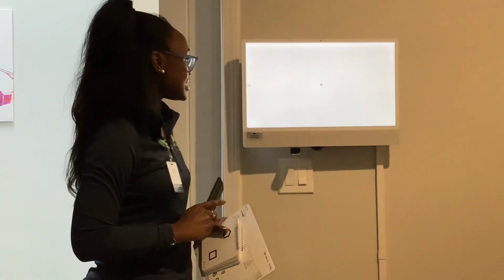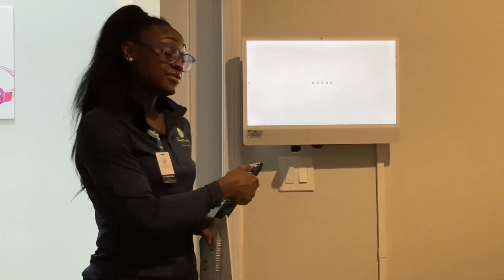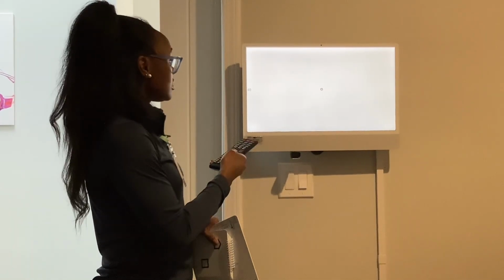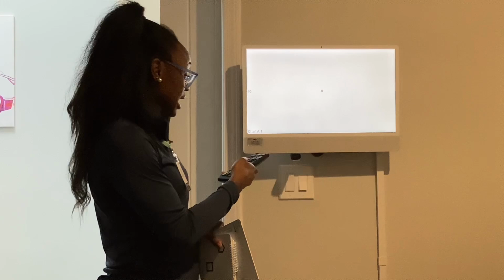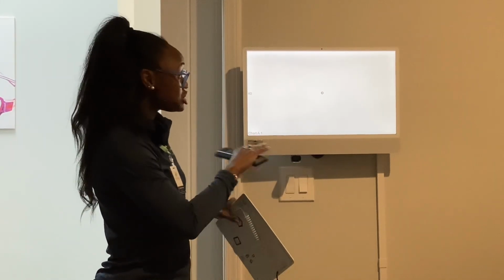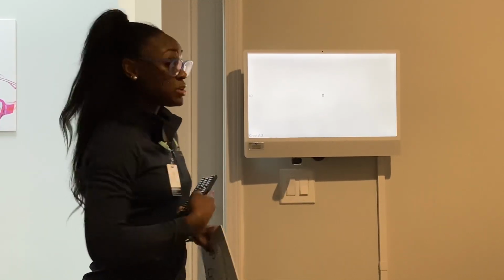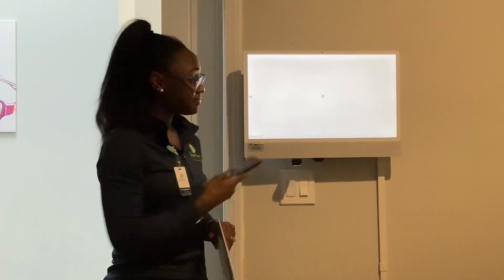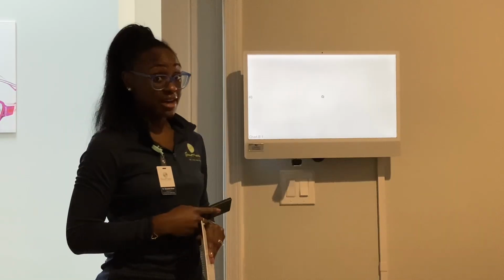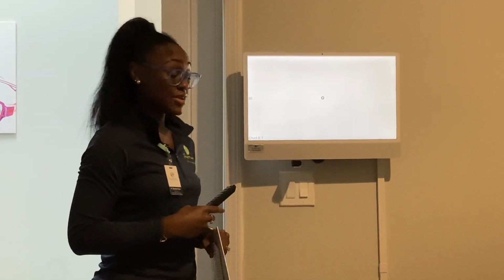If they miss a shape, let's say the circle is a square. Instead of showing the full line, it's very confusing for a little kid. We do not do that. Let's isolate. We have a circle. They missed it. Now, what do we do? We change the shape, but maintain the same level of acuity. Do not change anything but the character on the screen. Now we change it to a square. They missed that. They have a few more chances. This is a house. They missed that. Their acuity is now 20/50. Is that understood?